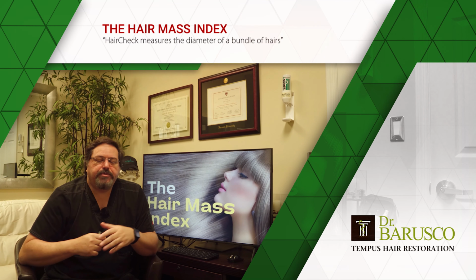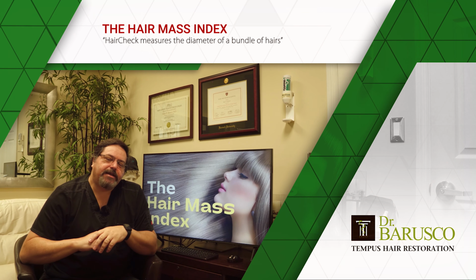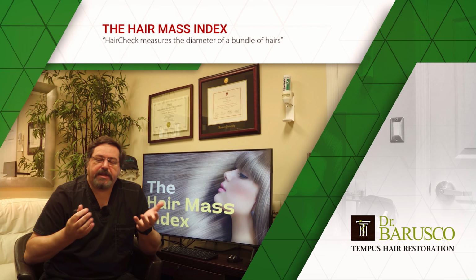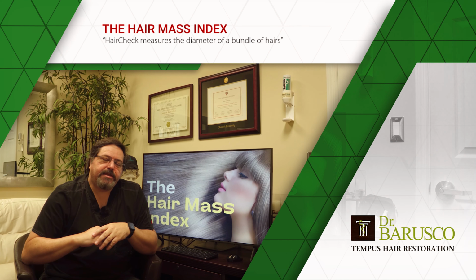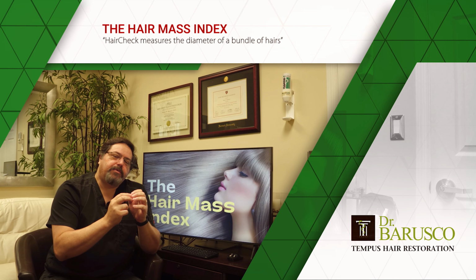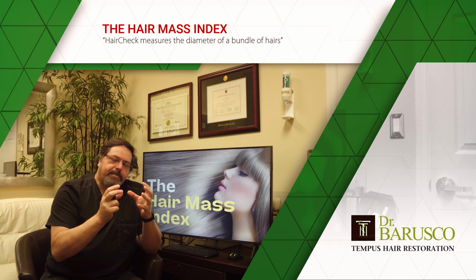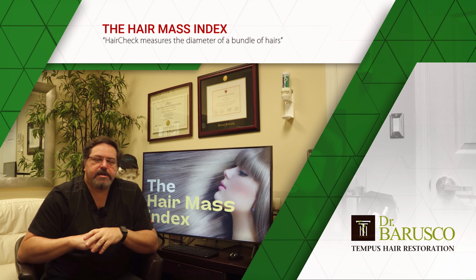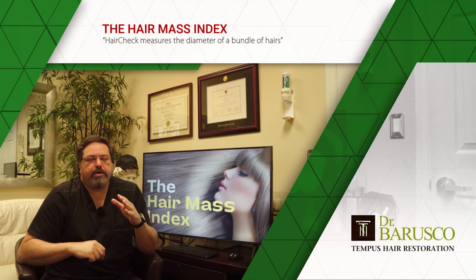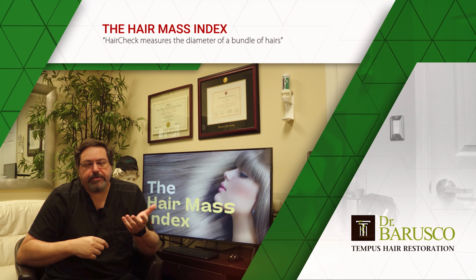It's a very simple diagnostic tool. There's going to be a video here following this explaining step by step how it's done. It's painless and it can be done very quickly. What it is basically, it'll give us a number, which is your baseline number of a certain bundle of hair that we separate from your scalp from different areas. And that number we can track over time if it increases or if it decreases or if it stays stable.